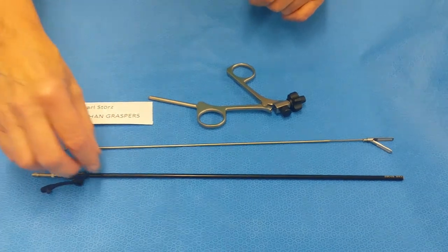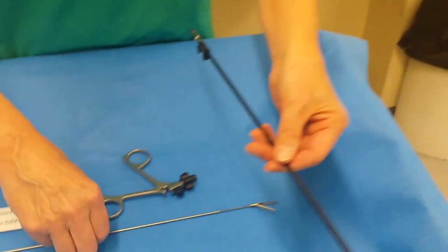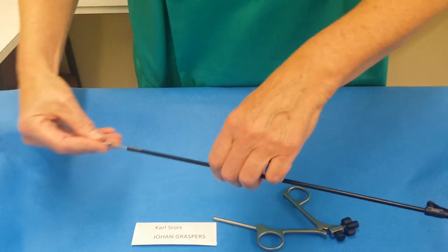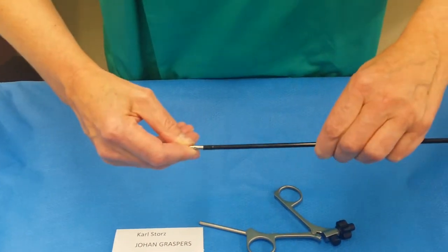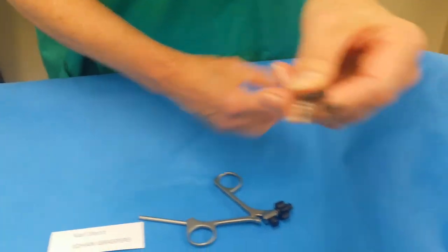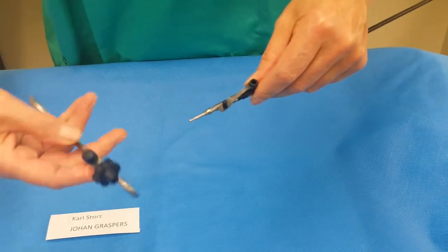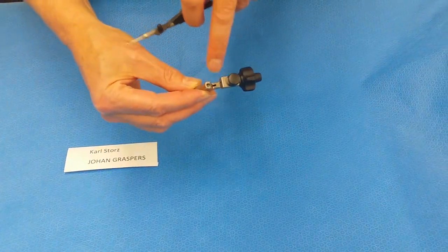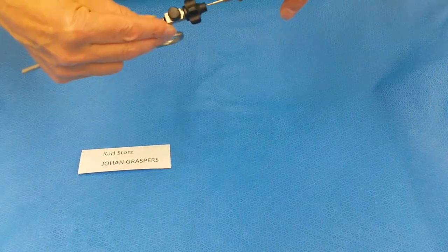The first thing you do is you take the sheath and you take the insert and you put the insert into the sheath. Push it through all the way, turn it 1/4 turn at the bottom end, make sure that secures it. Open the handle fully so that this hole and the indentation here are lined up.